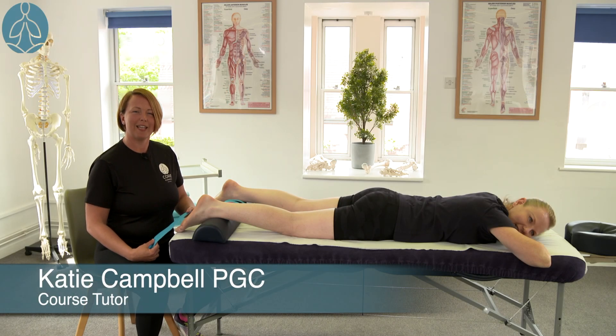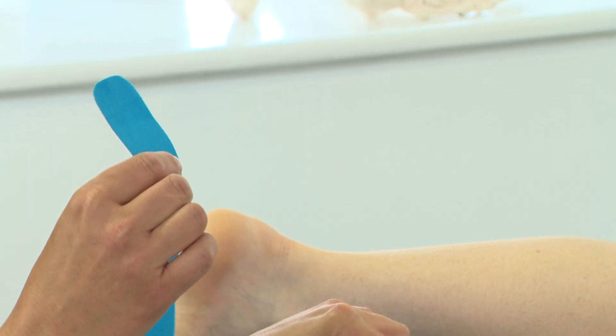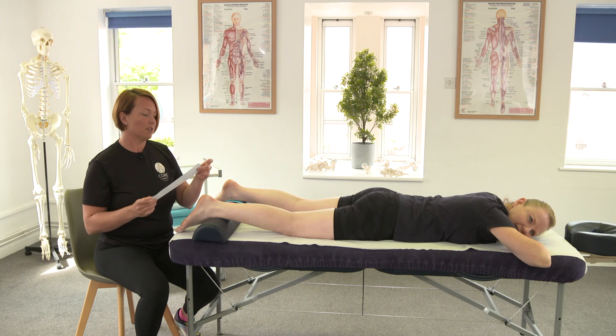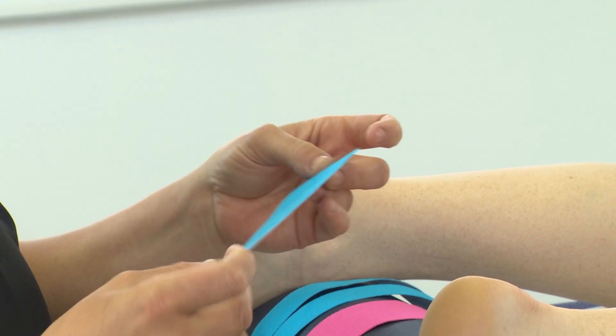In this video I'm going to demonstrate taping technique for plantar fasciitis which also supports the soleus and gastroc. We've cut the tape in different shapes so we've got eye strips, a decompression strip, and we've cut an eye strip in two. We've rounded the corners off — this prevents it from peeling. The client can also trim the tape if it starts to peel as the days go on. Ideally we would keep the tape on for between five and seven days.